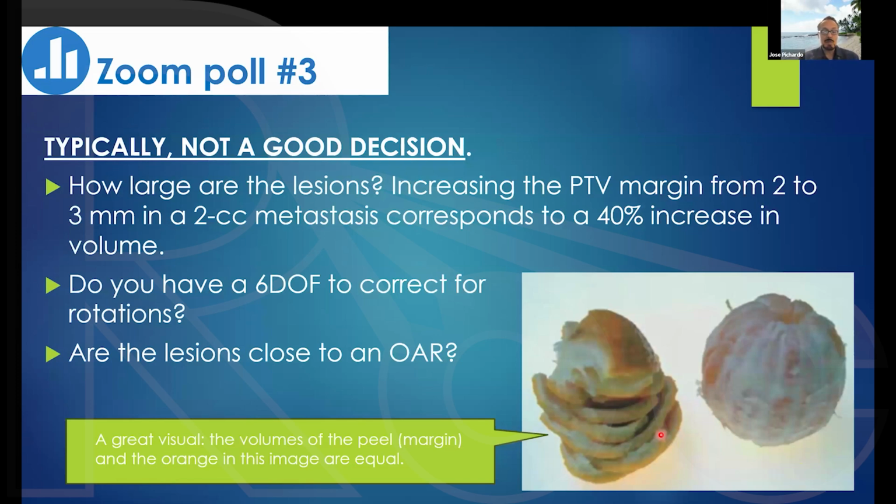The drawback of doing that is that it takes longer to treat the patient, because now you're treating the patient with 2 separate plans. So that's 2 separate setups completely, right? So instead of half an hour, it takes you an hour, right? But in terms of plan quality, you're going to deliver a much better plan if you do it that way. So I don't have one answer for that question. It depends on the distance from the lesion to the isocenter, primarily.